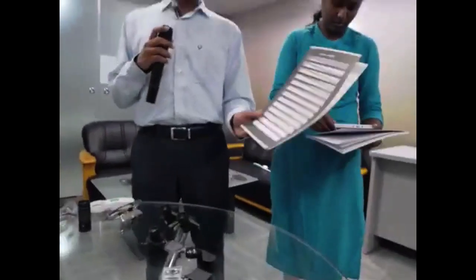This is the simple letter writer. Many times what is required is for us to understand the patient's need, and then we can go ahead in terms of modifying for the day-to-day requirements. Sometimes, as an example, a patient required a spectacle magnifier, and because he still wasn't happy with the amount of magnification, what we did is we added this along with the dome magnifier. When we do a combination, the patient gets better magnification and was happy. They found it convenient and were able to do their own tasks.